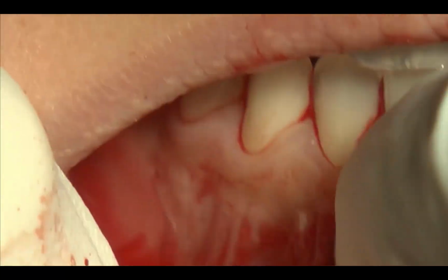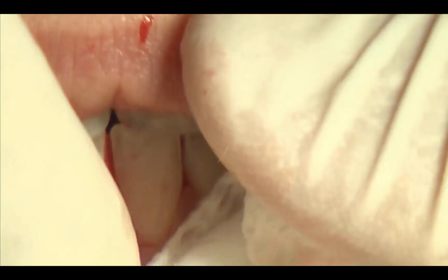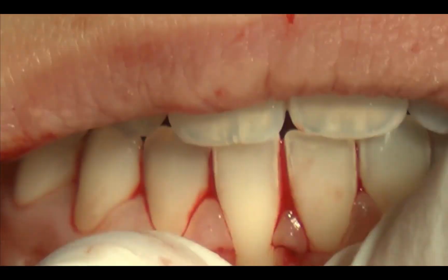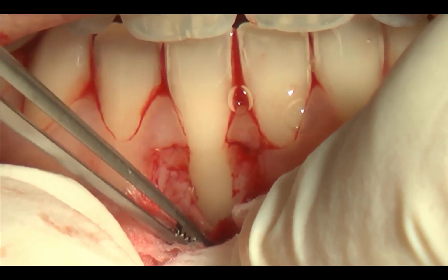And you will see that thanks to the removal of this submucosal tissue, it will completely stop bleeding in a very few minutes. During this time, you maintain a gauze compressed in apical direction, you expose the root, and you start with the root planing procedure. Have her breathe a bit through the mouth.